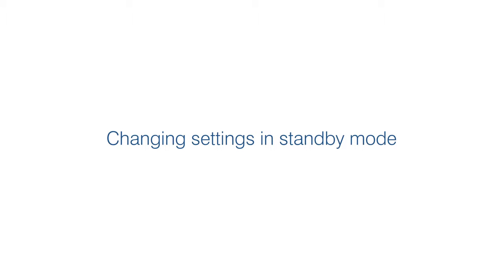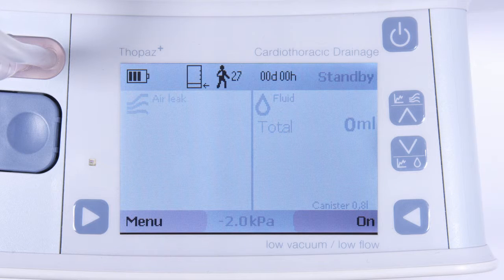Changing settings in standby mode. To change settings, such as pressure or pressure unit, press the menu button.